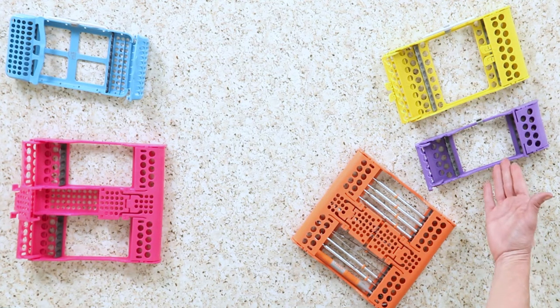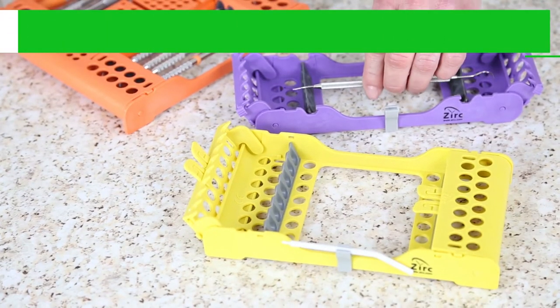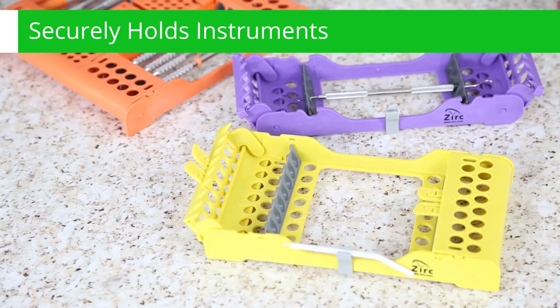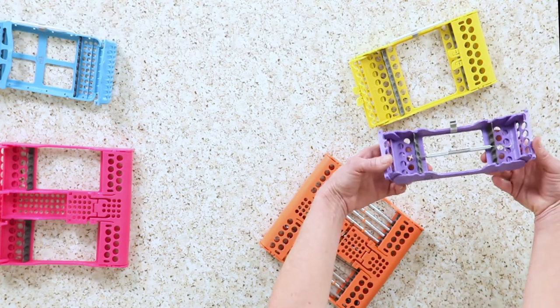The smallest cassette has room for five instruments. Flexible rubber slots hold the instruments securely, even when the cassette is open during procedure operations. All the cassettes have safety locks in the closed position.